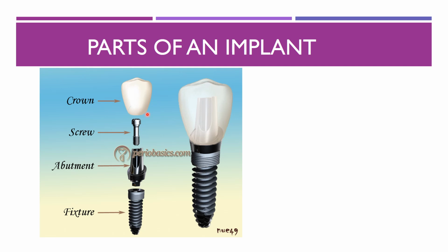So this cover screw can be called either a cover screw or implant obturator. Okay. So in this two-stage implant, this will be placed to prevent soft tissue and bone from invading the abutment connection area during healing. Whereas we have a healing abutment also over this. So if it is a non-submerged type, we give the healing abutment. So it will come over it. Okay. So that is to heal or shape the gingival tissues after uncovering procedures for the future implant placement.